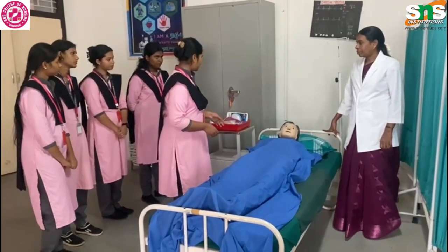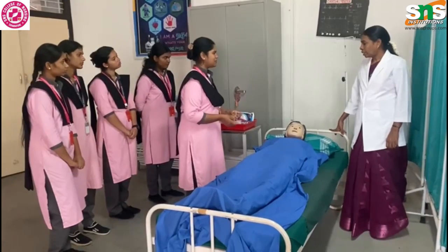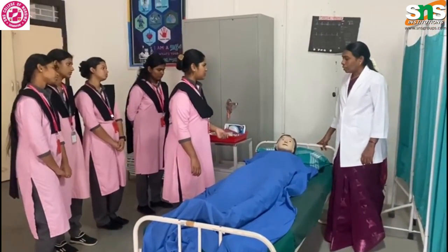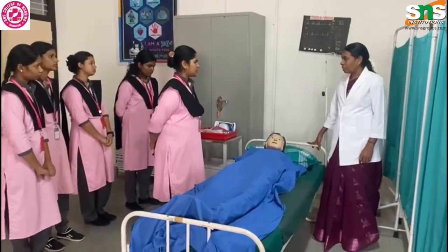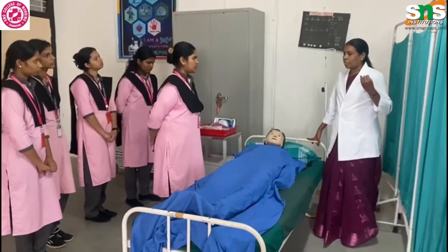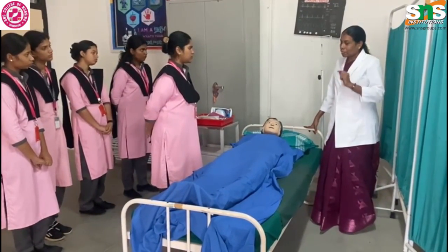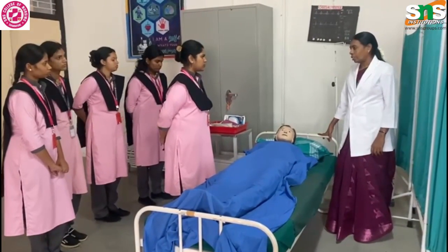Then we have to feed. You have to take the barrel of the syringe and connect it, and based on the physician's prescription, you have to feed the patient, whether it is medicine or the diet or the liquid, whatever it may be. Only with the consent of the physician can we feed the patient, or else you don't touch anything.